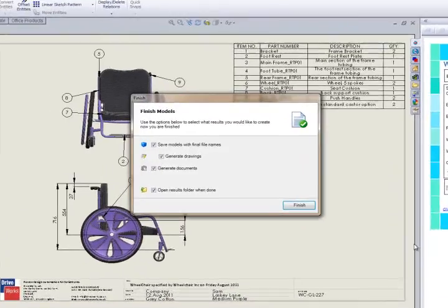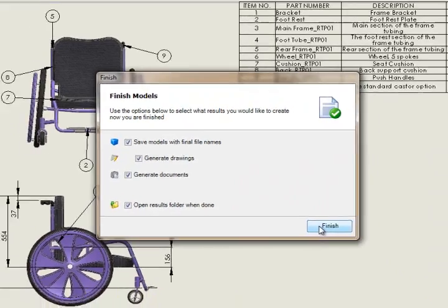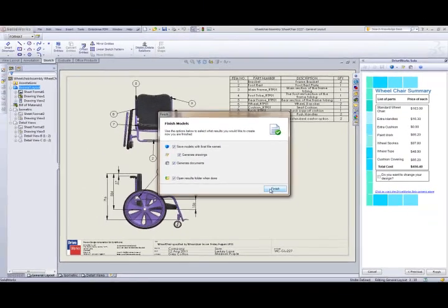At this point, we are presented with a finished dialog, where we can choose whether to save the models, save the drawings, generate the documents, and whether or not to launch Windows Explorer when DriveWorks Solo has finished generating all the models.